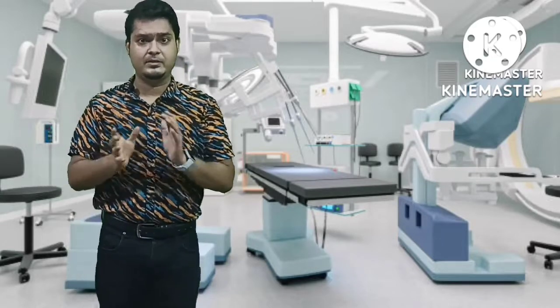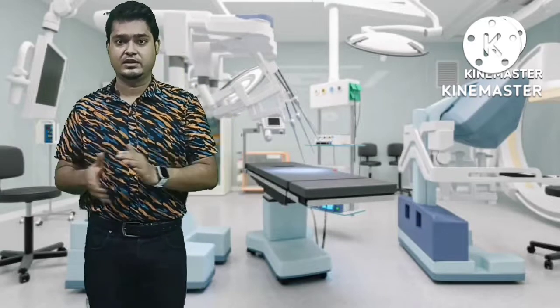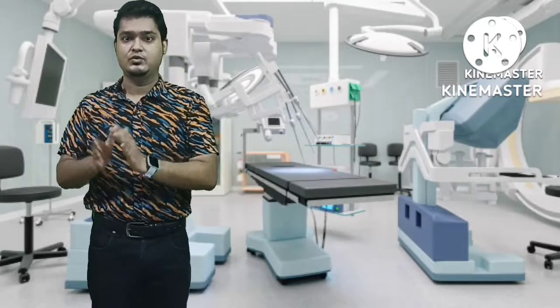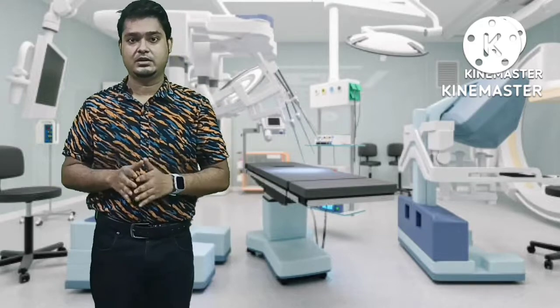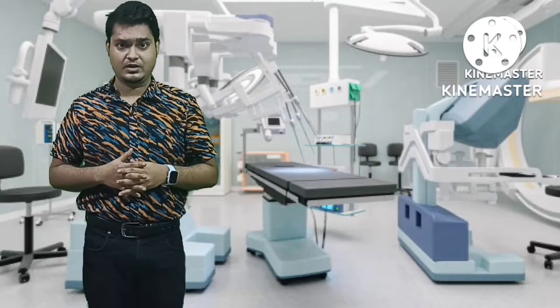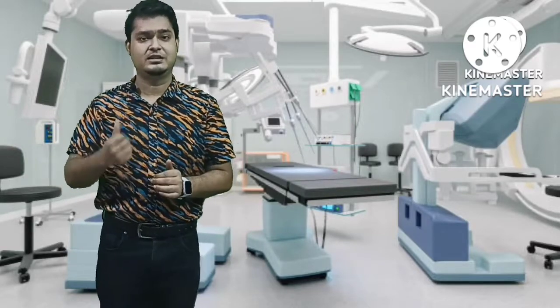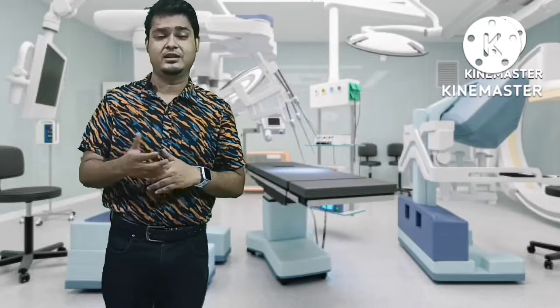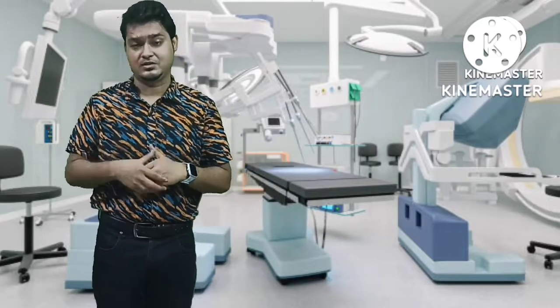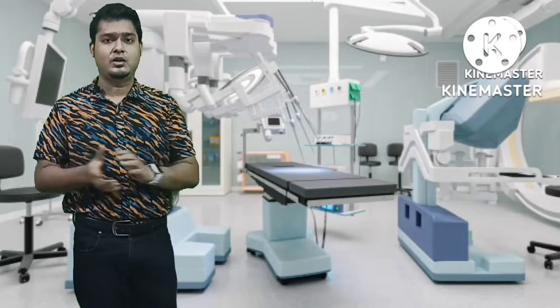After performing the examination, ask the patient to wait in the observation area, and observe the patient for about 30 minutes to 1 hour for any kind of contrast media reactions. If the patient has a contrast media reaction in that time, you can give medication and save the life of the patient, or prevent the contrast media induced effect. So this is all about this topic.